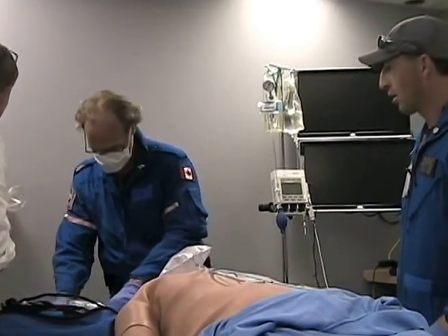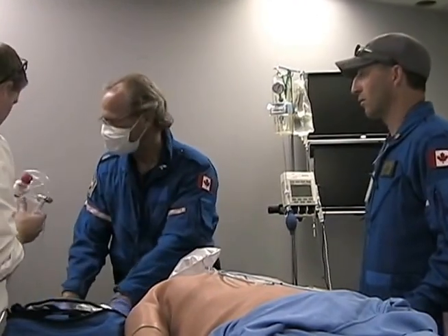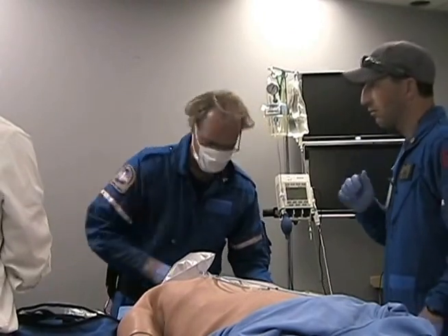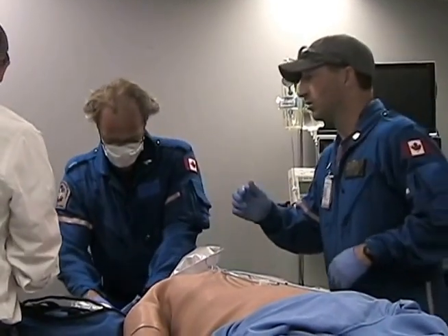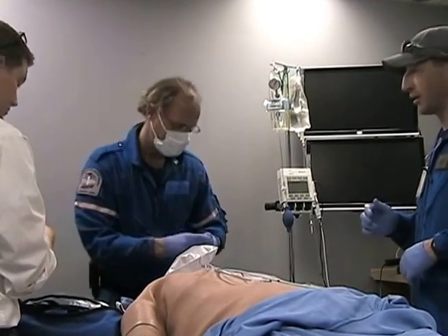Sounds good. Okay. Can we hook this up to the BVM? Yeah, actually, you know what, you can, because it should fit with the mask there too. That way we have it, worst case scenario. Can you get it there, or do you want Bruce to help you? You got it this way, right, Bruce? Yeah, that can work. You betcha.